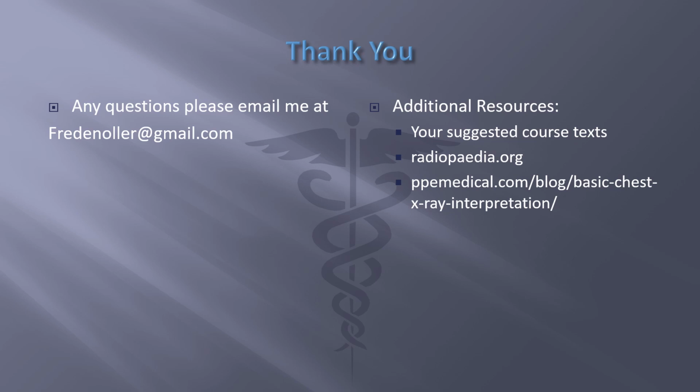Thank you for listening. When you do chest X-rays, please create a system for your evaluation. Like I said, I like to use the ABCDE method, and when you utilize that every time you look at an X-ray, you will reduce the likelihood that you're going to miss something. When you order an X-ray for a specific reason, don't just look at the area that you took it for. Go through your system, do the ABCDE, look at the entire chest X-ray, because you may pick up something that you weren't looking for. And you'll be less likely to miss something.